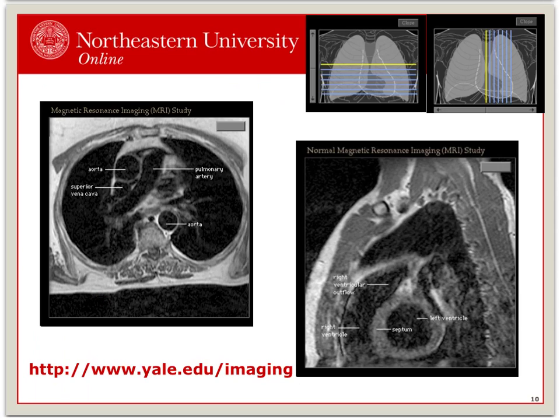Image 1 is an axial MRI showing the main and right pulmonary artery crossing under the aortic arch. Image 2 is a sagittal MR showing the midsection of the left ventricle, the interventricular septum, and the right ventricle. The scout films help you locate the approximate location of the image slice. With both sagittal and coronal views, we can better visualize dilation or dissection of the aortic arch or root.